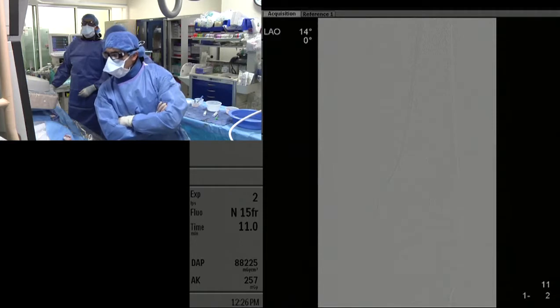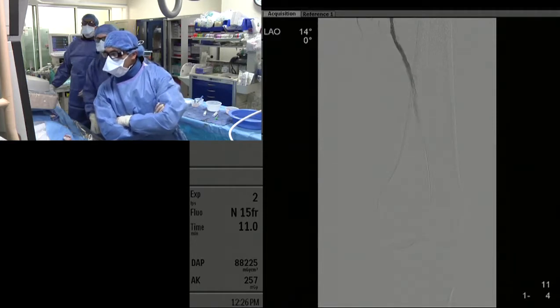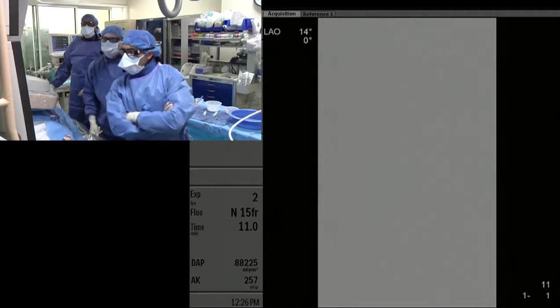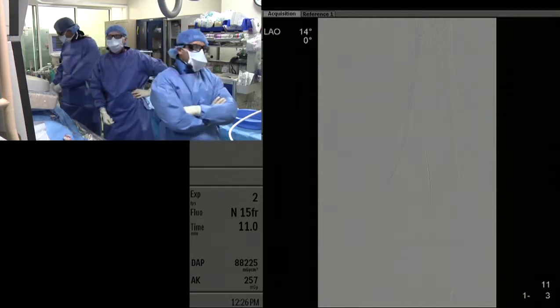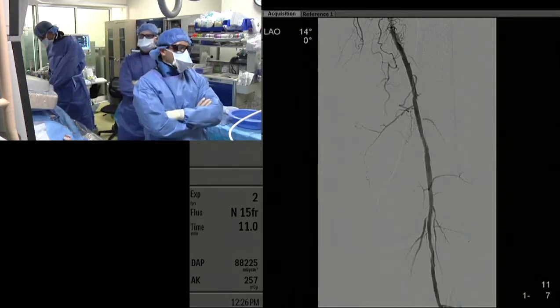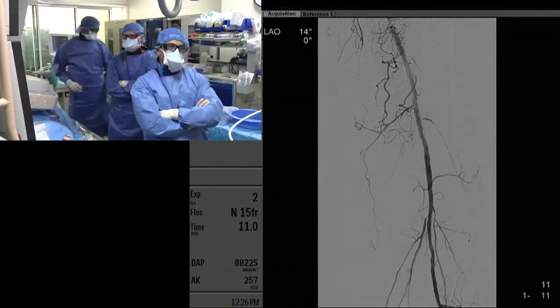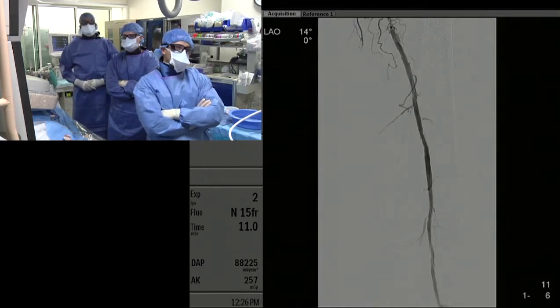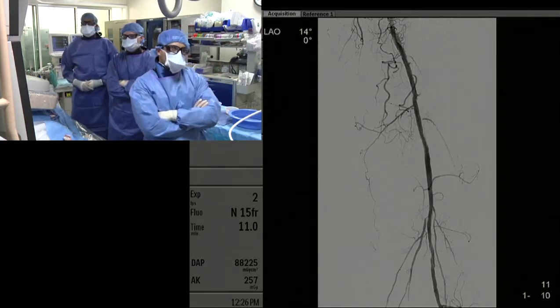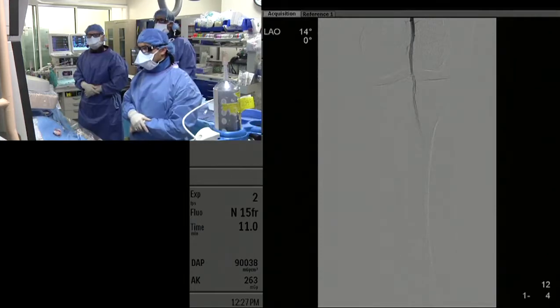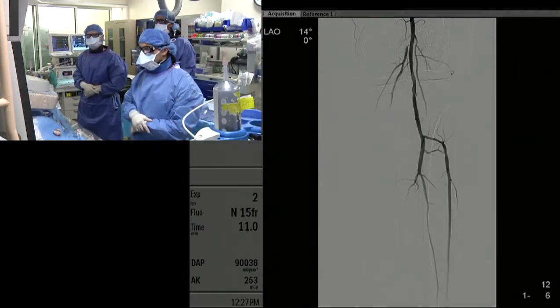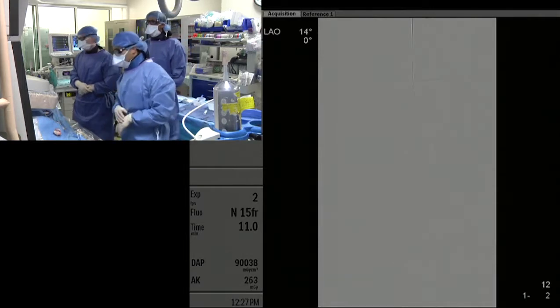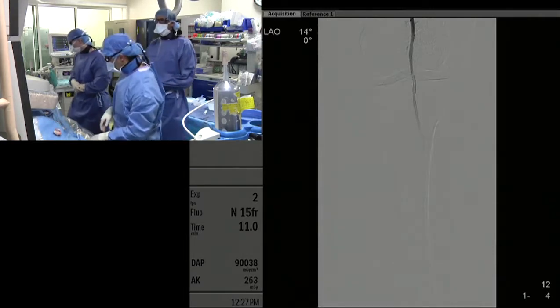There's some dissection there, but it doesn't look flow-limiting. Would anybody stent this just because there's a dissection, or leave it alone since it appears non-flow limiting? If it's non-flow limiting, I generally leave it alone, especially in that location because you're pretty close to the joint. The dissection is there, but not flow-limiting. It looks like the obstruction is resolved and the flow is better.